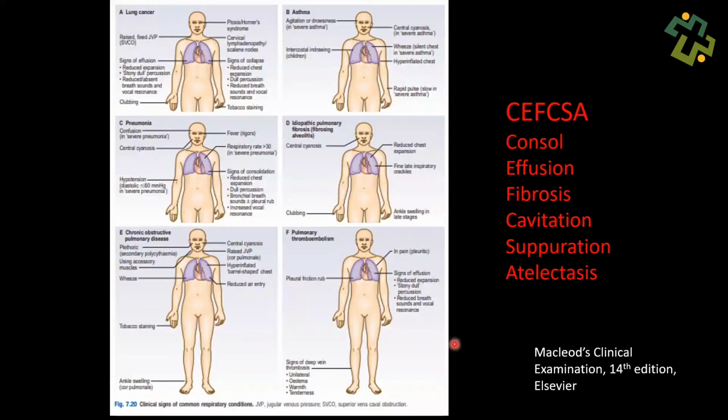And when we cover pulmonology in the diploma program, we look at the 6 stereotypes of lung disease. That's consolidation, effusion, fibrosis, cavitation, suppuration, and atelectasis. You can also include hyperinflation there, right? And these are the 6 cardinal kind of exam scenarios that they like to put in the exam. And we're going to go through each one of them and their features radiologically speaking.